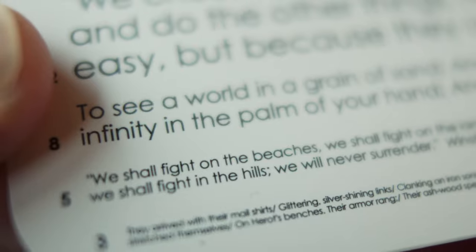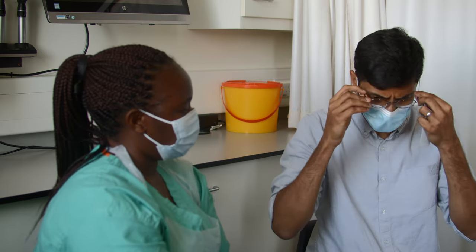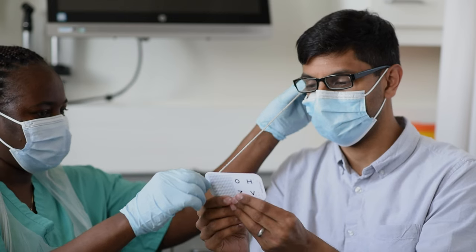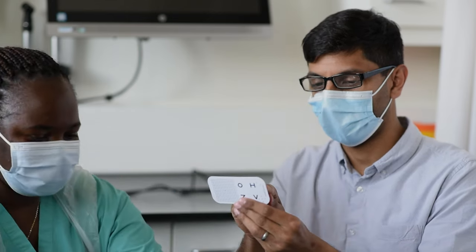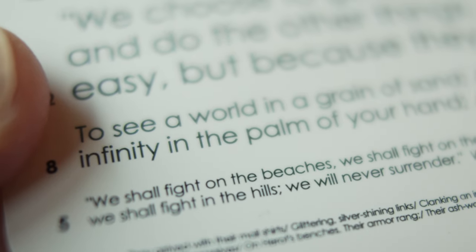If they cannot read the N8 line then try with plus 1.5 diopter sphere glasses. If they still cannot read N8 then use the next higher power, and so on until they can comfortably read N8 text.